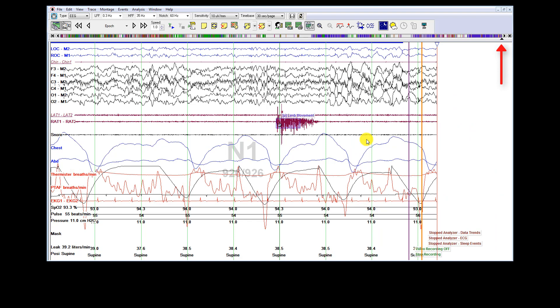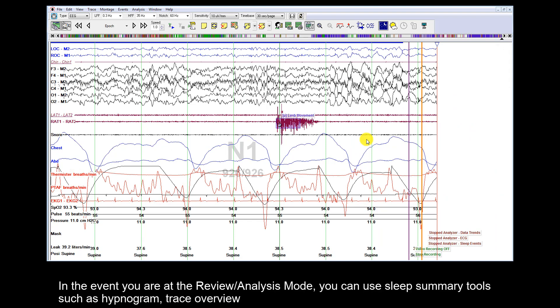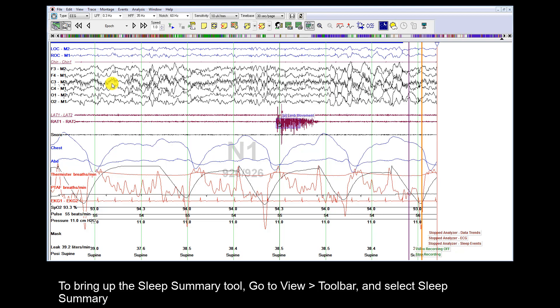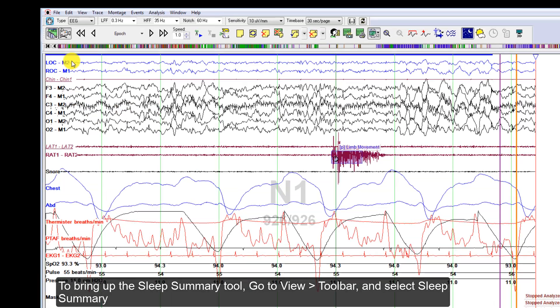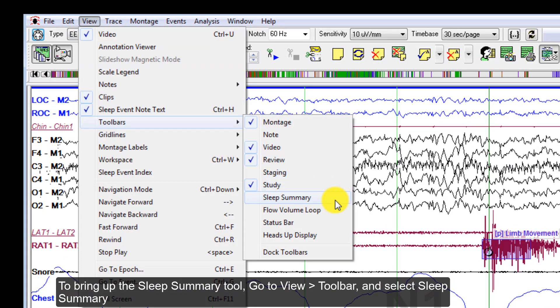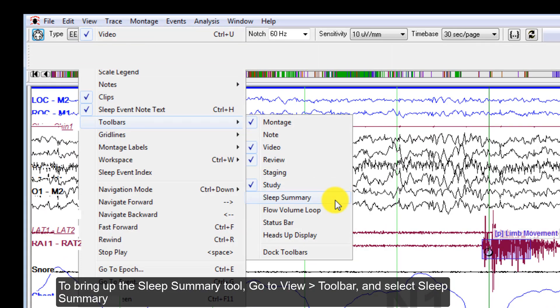In the event you are in review or analysis mode, you can utilize the Sleep Summary tools such as hypnogram, trace overview, or other trend summary graphs to navigate. To bring up the Sleep Summary tool, go to View, Toolbar, and select Sleep Summary.